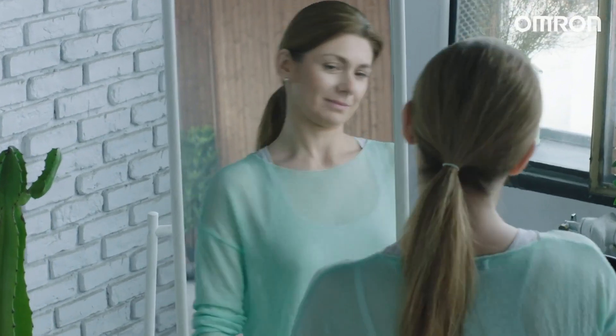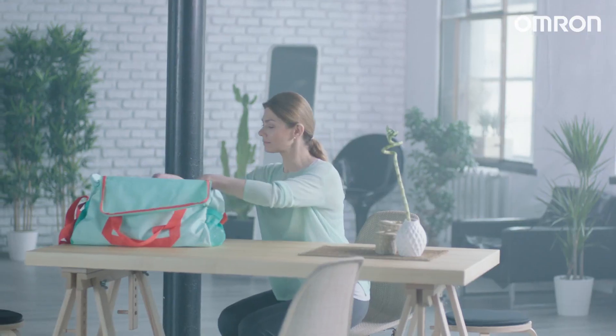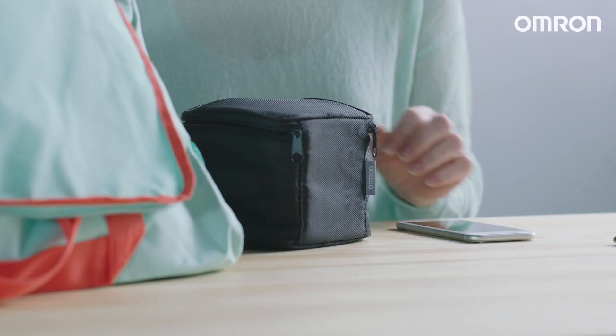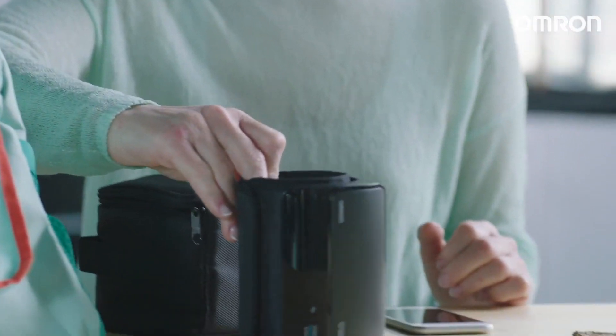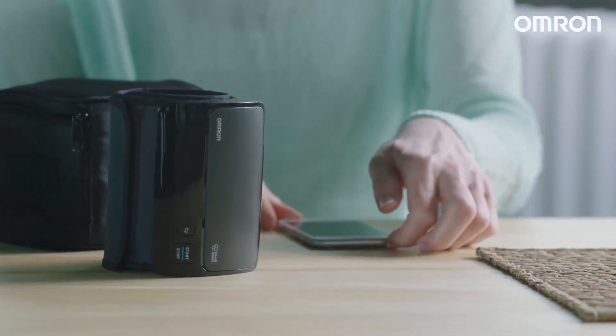Over the years, I realized that every moment is a celebration of life. I've embraced my age and accepted my high blood pressure condition. The new Omron Evolve helps me enjoy fully every minute of my life.